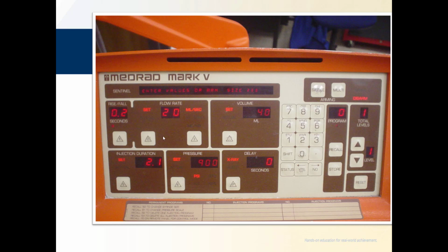Okay, over here, if we select the delta here, then we can change this 20 mLs per second to 10 mLs per second or 30 mLs per second. If we select this one, it's going to go from milliliters per second to milliliters per minute to milliliters per hour. Right here, this is the total volume to be delivered, 40 mLs.